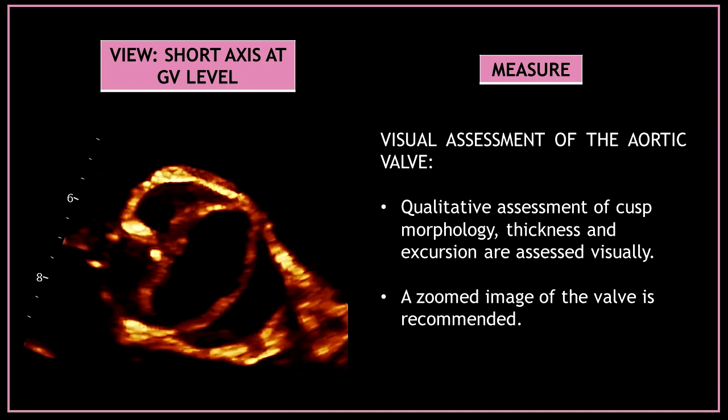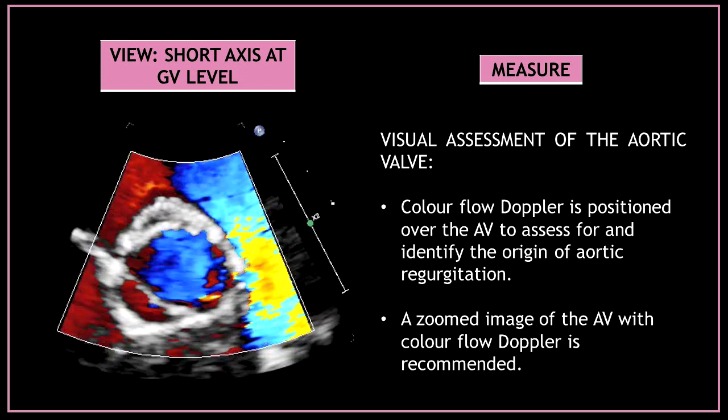Now start with the assessment of the aortic valve. A zoomed image of the valve is recommended. Perform a qualitative assessment of cusp morphology, thickness, and excursion. Place color flow Doppler over the aortic valve to assess for and identify the origin of aortic regurgitation. A zoomed image of the aortic valve with color flow Doppler is also recommended.